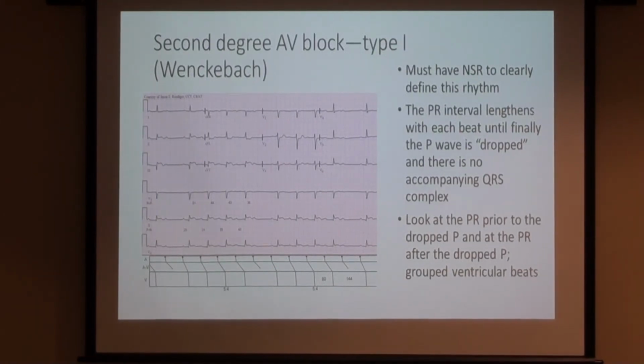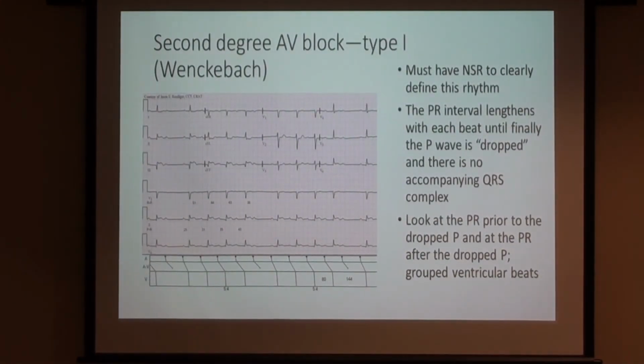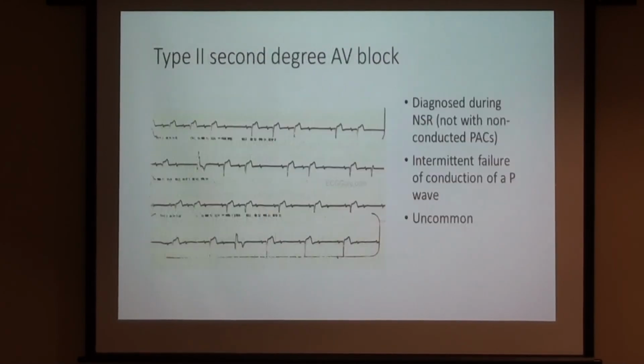You don't have to measure it out. Is it getting bigger? I'm not really sure. Look at the blocked one, the one after. If it's shorter than the PR interval before the block, Wenckebach block. Finished. Okay? All right.